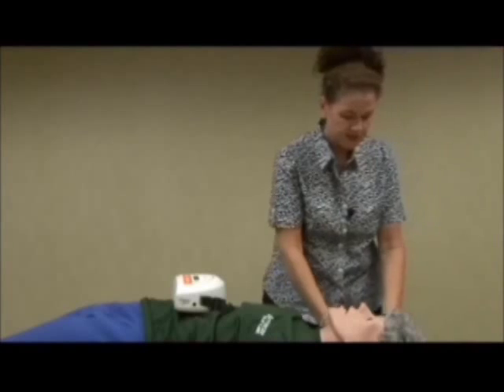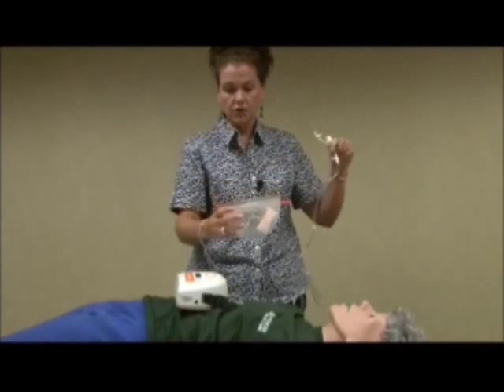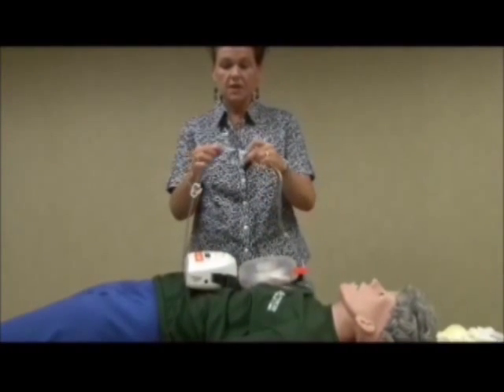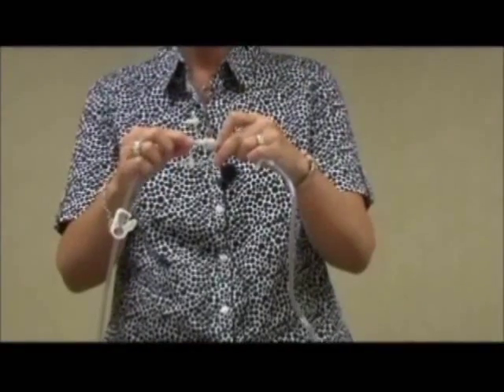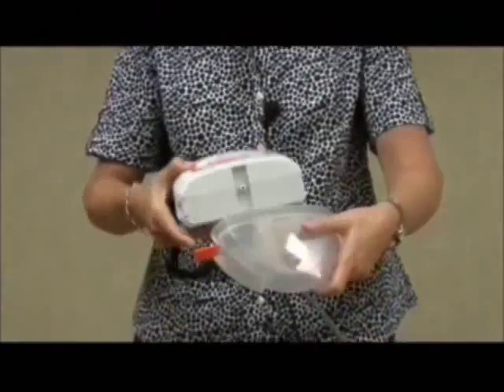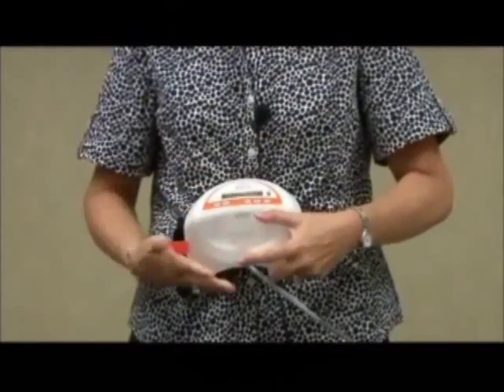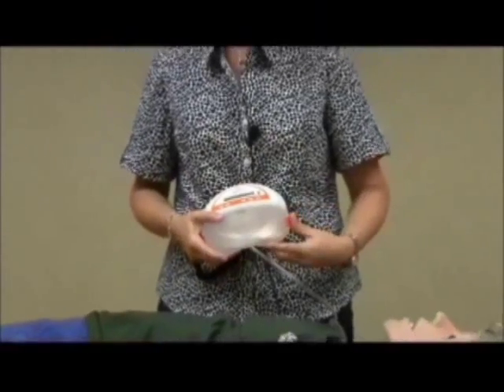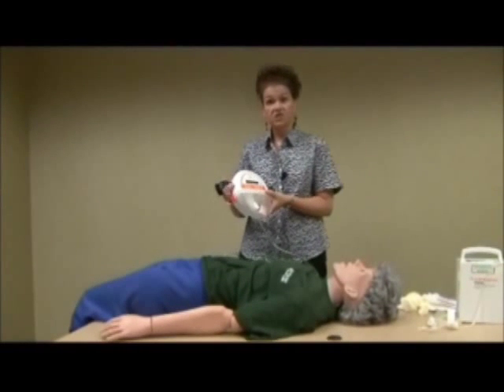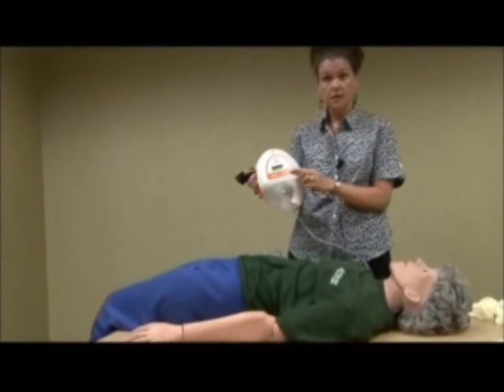You'll find a new canister packaged in your supplies, and you'll want to replace the canister on your machine by first connecting the tubing from your dressing to the canister. You should hear a click. Then you'll want to attach the canister to the bottom of the machine by simply pressing up on the machine with the canister and clamping the two orange clamps. Then turn the machine back on by pressing the button that's furthest to the right.